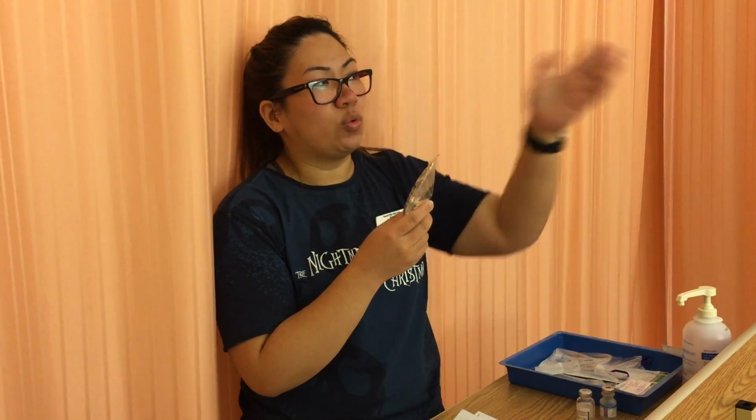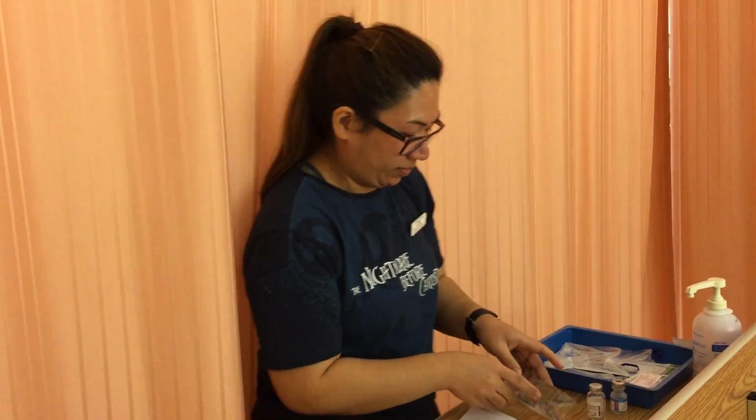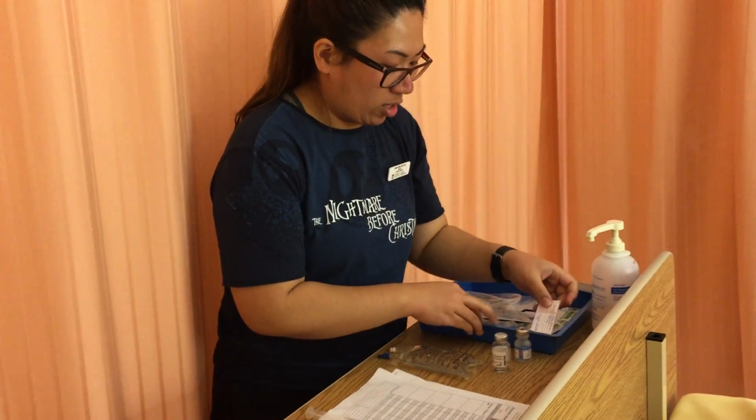And I would run this for the whole hour or 60 minutes, so I have extra time to catch any adverse effects because this is the patient's first time to get the cefoxitin medication, and so I have enough time to close the infusion right away before it gets any worse. All right, and now I can also do my label.